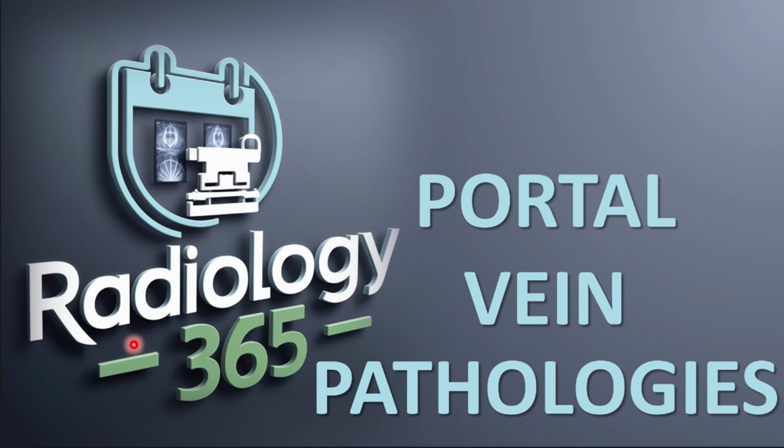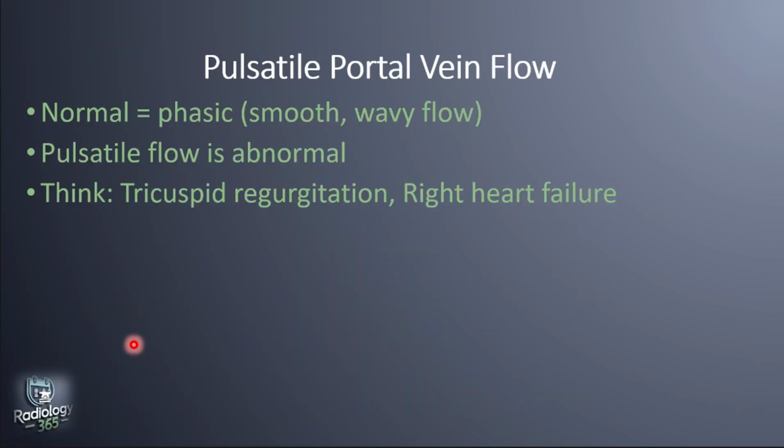Today we're going to be talking about portal vein pathologies. Normally, the portal vein has a smooth, gently wavy flow pattern. We call that phasic. But if the flow starts looking pulsatile, like arterial, that's a red flag. When we see this, it often points to heart-related issues like tricuspid regurgitation or right heart failure.